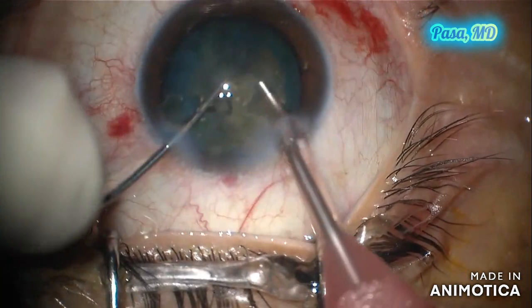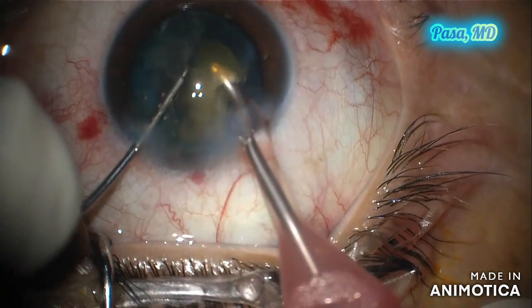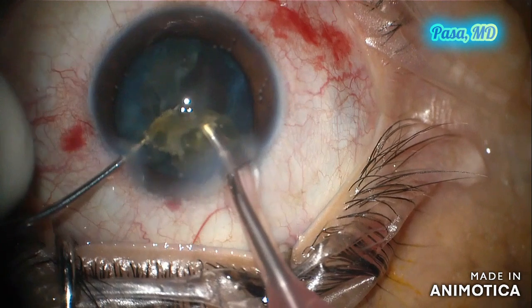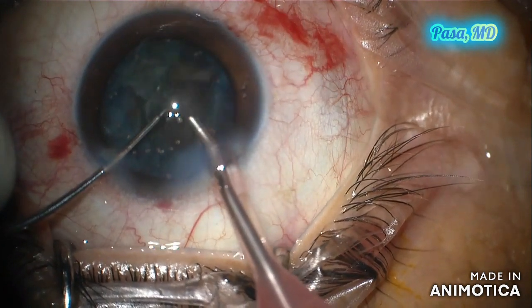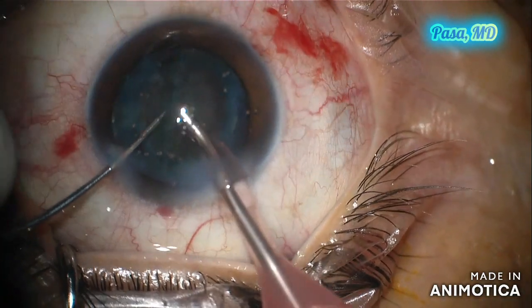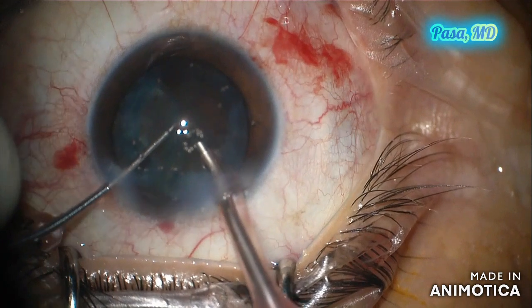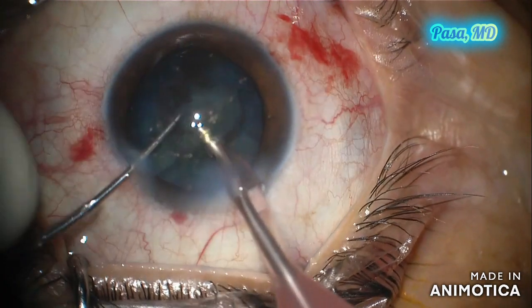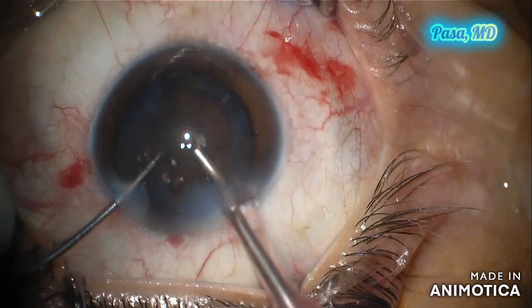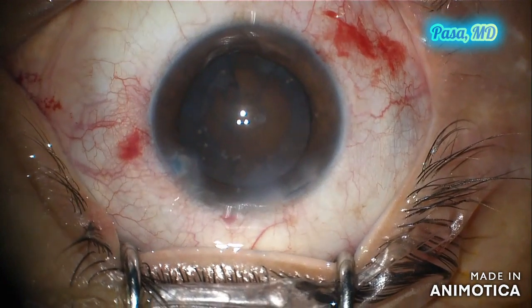The patient is very cooperative and obviously there's no language barrier, so following commands is excellent. Here we're removing the nucleus. Making sure the posterior capsule doesn't get any surges, switching to epinucleus mode, and then placing the chopper in the protective position so the posterior capsule doesn't hit the sharp phaco tip. Then it's time for irrigation and aspiration.